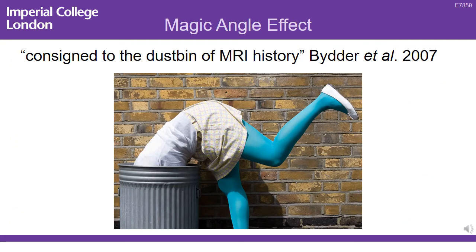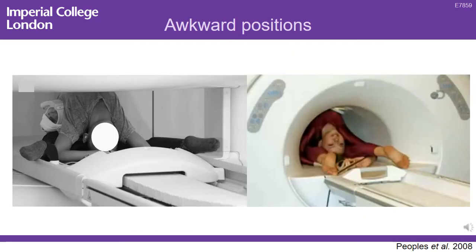That artifact is the magic angle effect, which is an intriguing conundrum. It could offer so much as a new contrast mechanism, but mostly offers clinicians confusion. It's viewed as a hindrance because it mimics pathology, has been revisited time and time again, especially after advances in MR scanner technology, only to be thrown in the dustbin when something easier comes along. That's basically what happened to me.